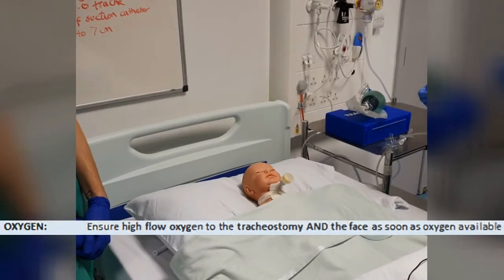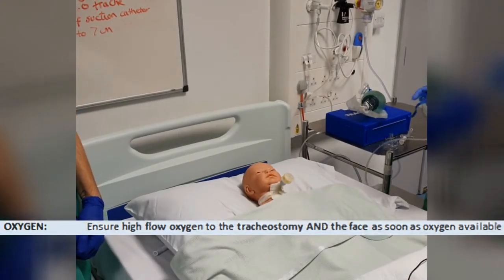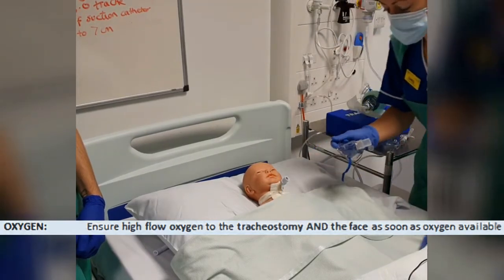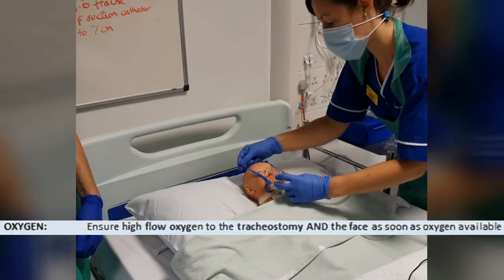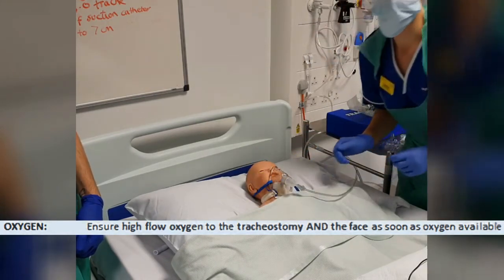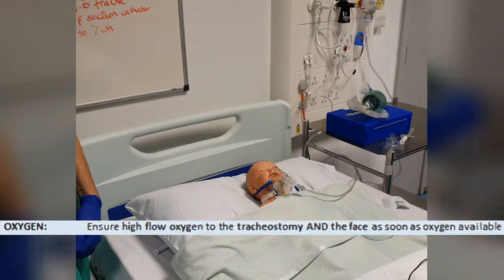The next stage is to ensure that high flow oxygen is applied to the face and tracheostomy. If you have a non-rebreathe mask to hand, use that. If you have a face mask, you can use that until you have something else available.